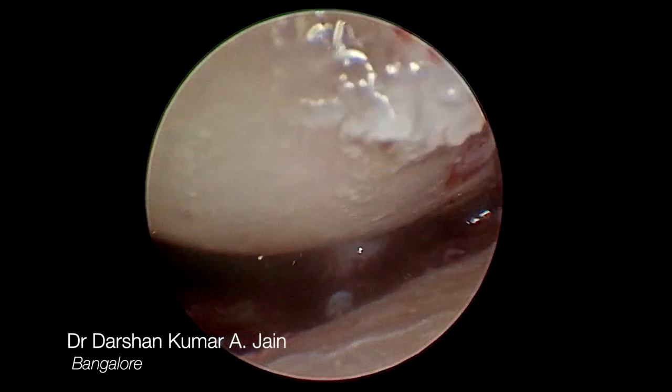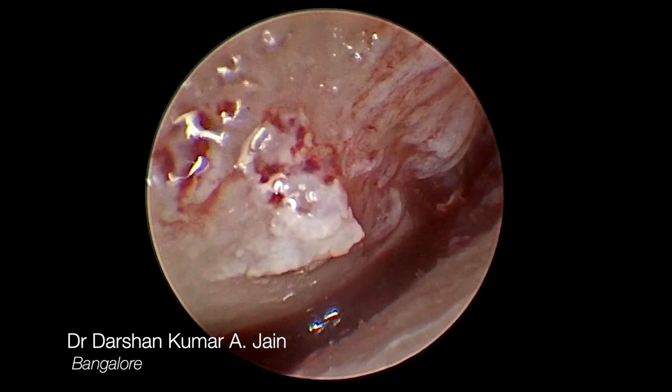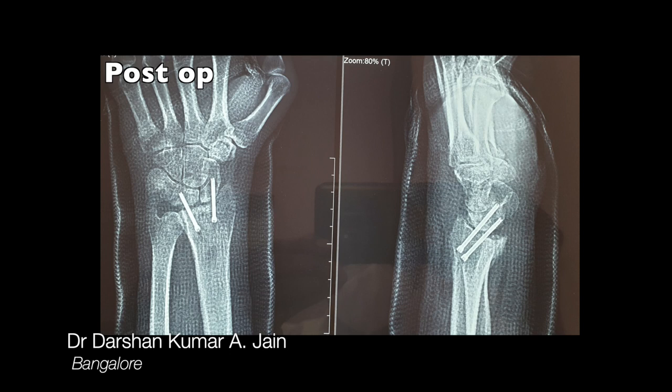The traction was released and a good congruent reduction was confirmed. Under fluoroscopy, two headless screws were passed stabilizing the wrist joint through a small incision. Postoperatively, the x-ray showed good position.